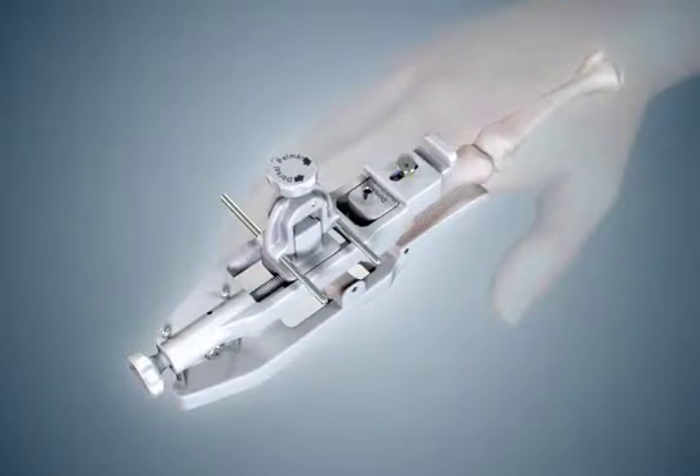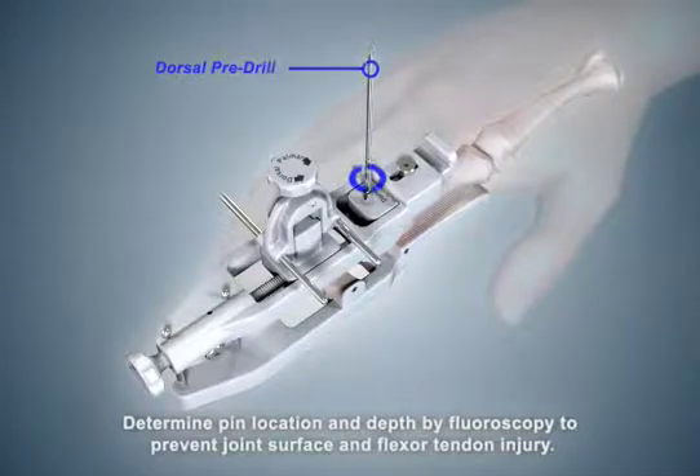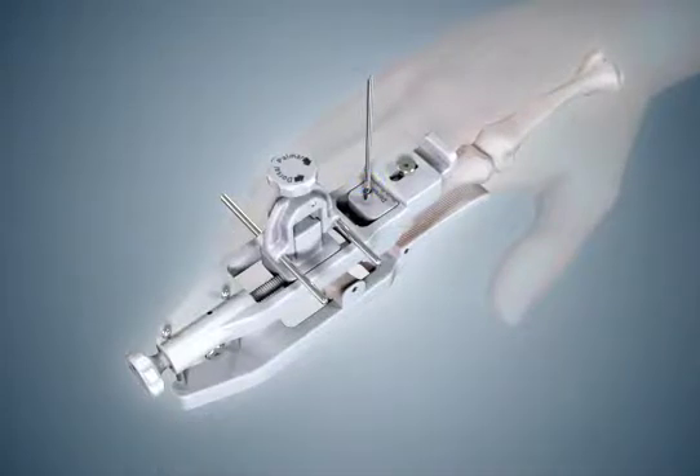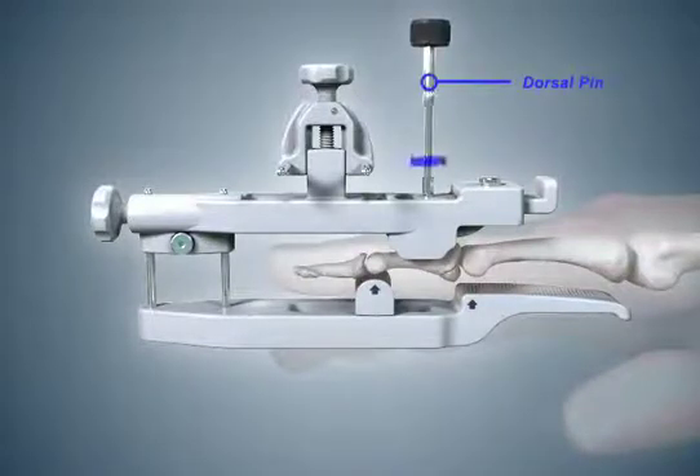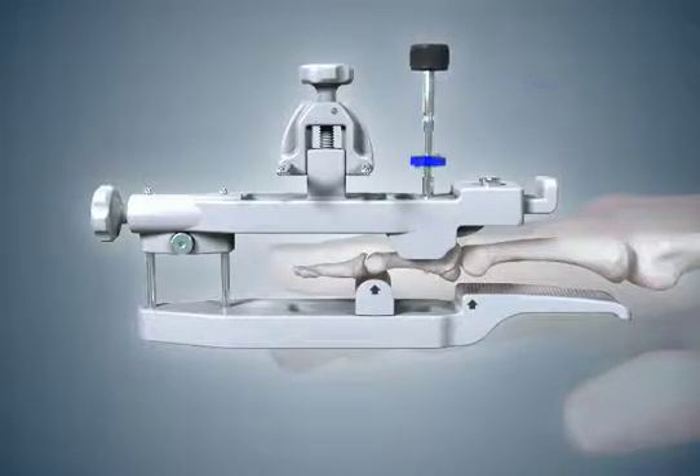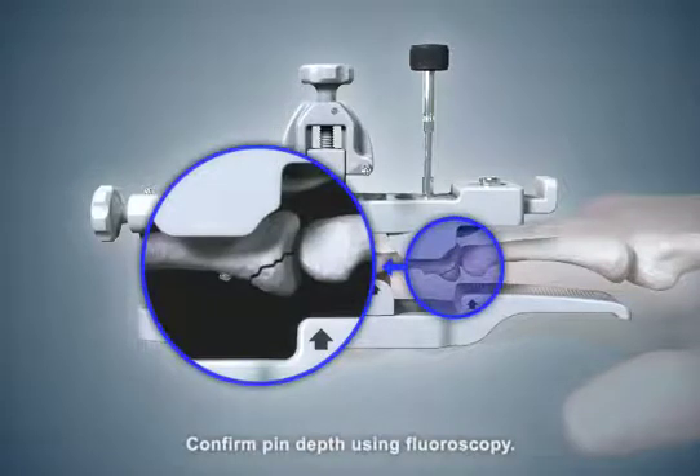Use a power drill to insert the pre-drill through both cortices of the middle phalanx. Keep the drill guide aligned with the pre-drilled hole and remove the dorsal pre-drill from the bone. Select the dorsal pin and manually thread it into the middle phalanx by rotating it clockwise into the pre-drilled hole. The pin should extend through the palmar cortex but stop short of the flexor tendons.